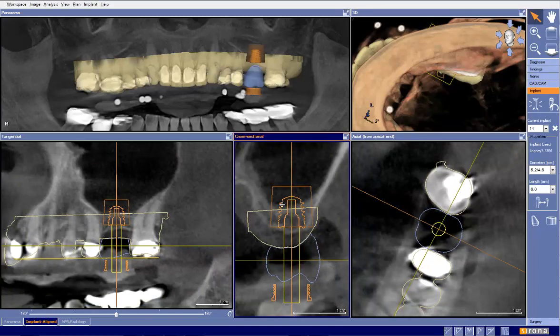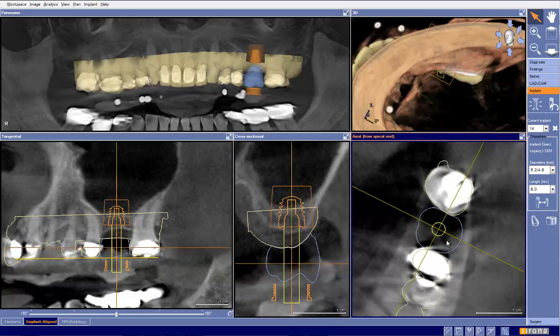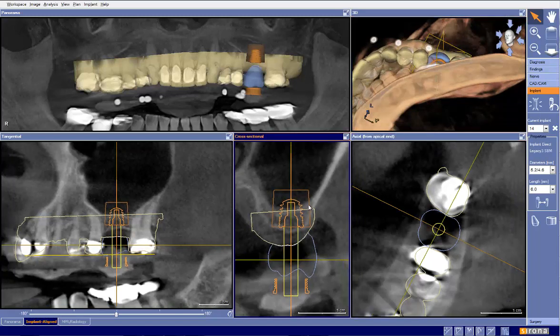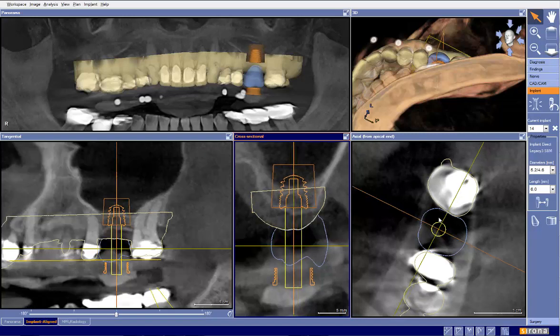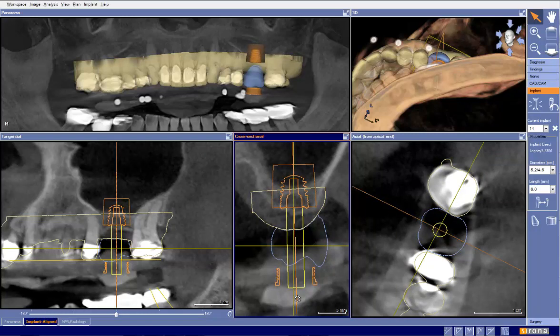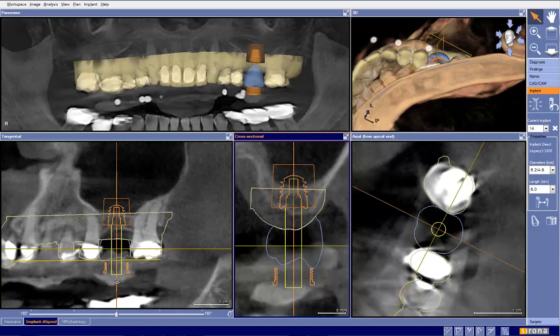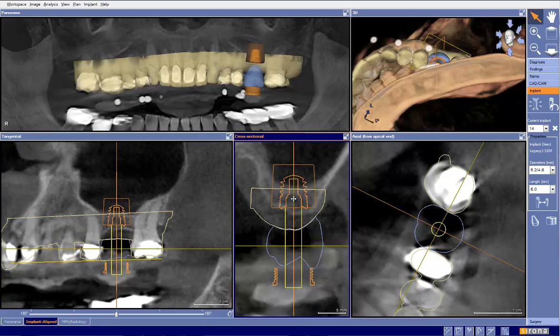My initial assessment is that this implant is probably a little bit too buccal. But when we look at it in the occlusal table view, we can see it's centered on the restoration, and the restoration is not designed too big — it's actually designed quite well, minus the buccal margin. What I would do in this case is move the implant over to the middle, which will move it to the lingual, and then tilt the implant a little bit from the head and a little bit from the apex to get it back into alignment. Now we have a more ideal placement with buccal bone and lingual bone.